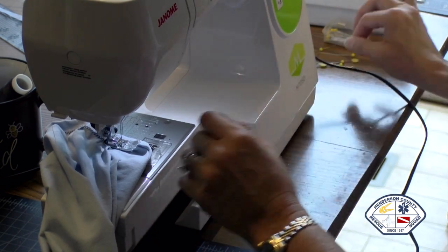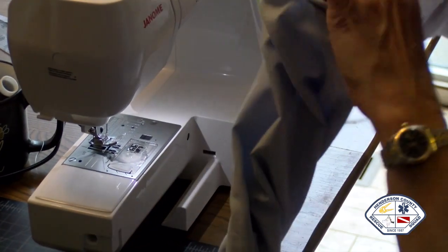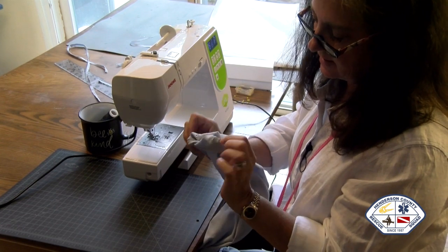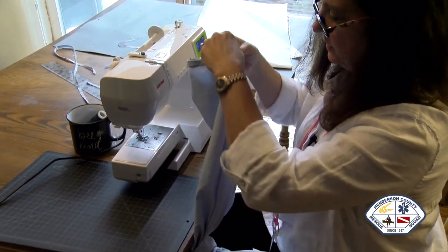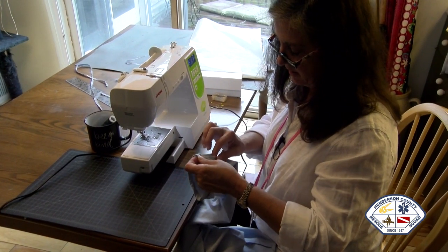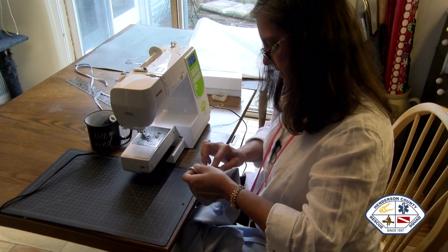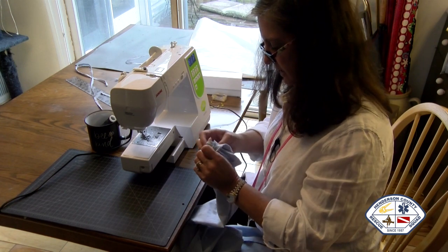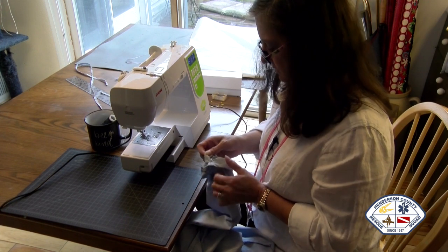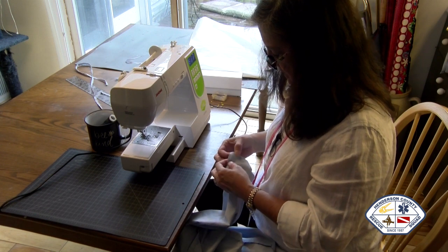Perfect. Then we've got a sleeve that's hemmed. No excess fabric on the inside to fray when we are washing it. And now I don't think we need, yeah, let's go ahead and do that. Let's put a little zigzag over the edges.